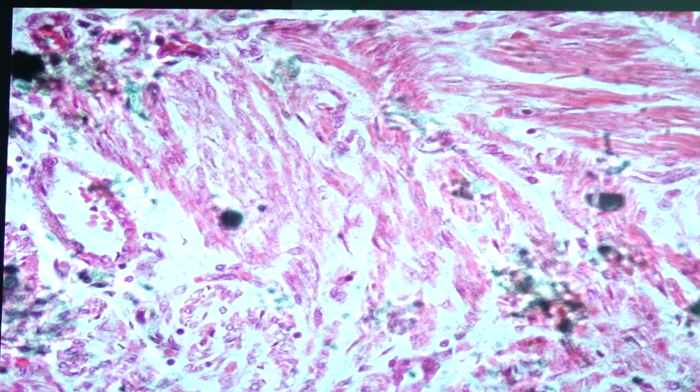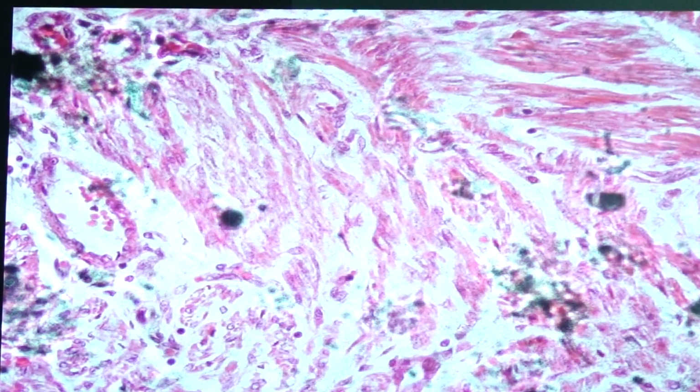There are several variants for Leiomyoma. Generally, they have a very low mitotic index, meaning you would have zero mitotic figures. Number one is cellular Leiomyoma, which means that there's an increase in the number of cells. Symplastic means that it's bizarre: you have the presence of large cells having bizarre nuclear features.